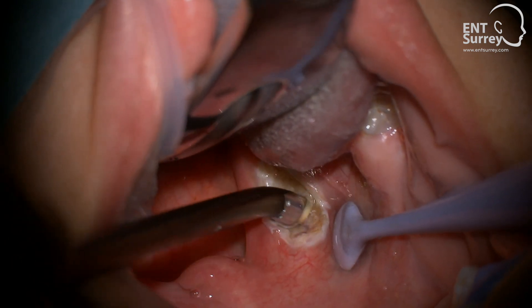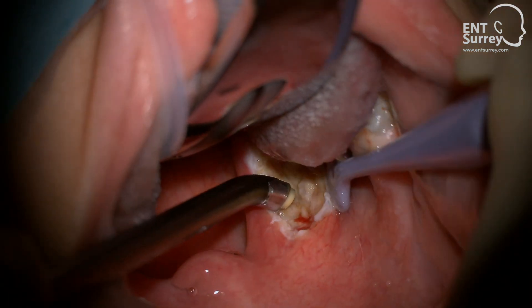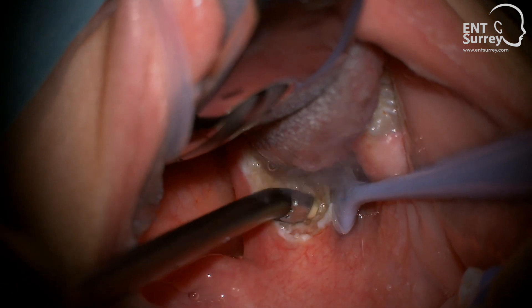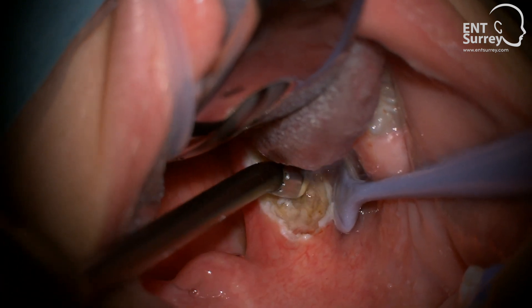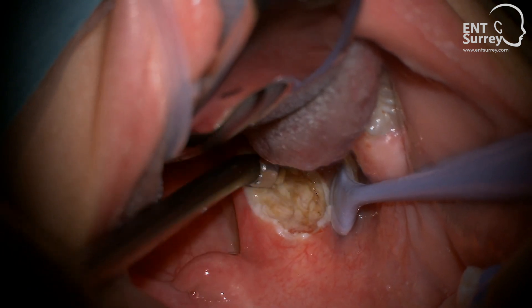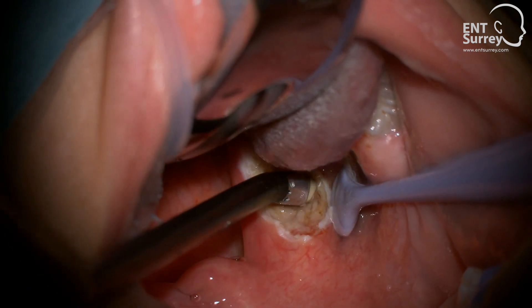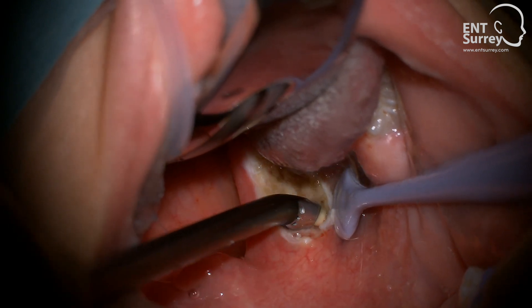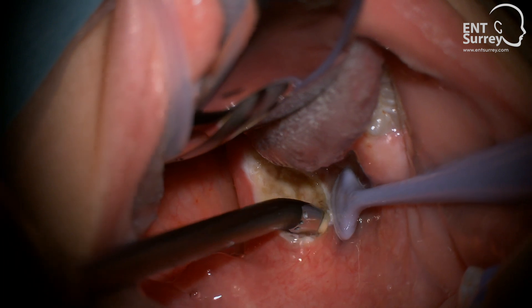Coblation on the tonsil results in rapid tissue removal. I use sweeping movements or a dabbing action to remove tissue across a broad front. The face of the wand is used to make gentle contact with the tonsil, but one must take care not to dissect with the wand or to push too hard. In adult cases, it is usual to need to retract the anterior pillar to gain access to embedded tonsils.